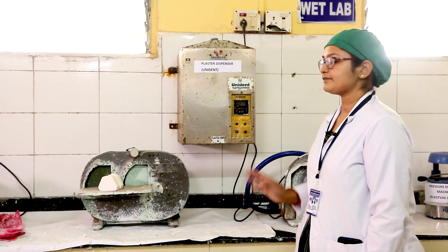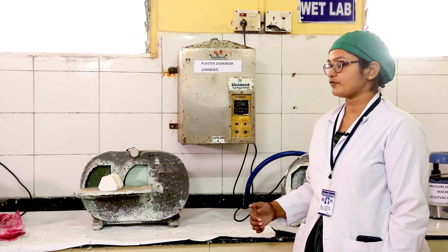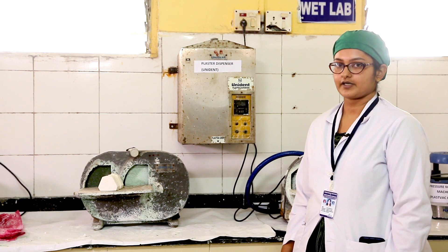This unit is a plaster dispenser. Here the dental plaster, from which the model is made, is stored to prevent any moisture contamination.